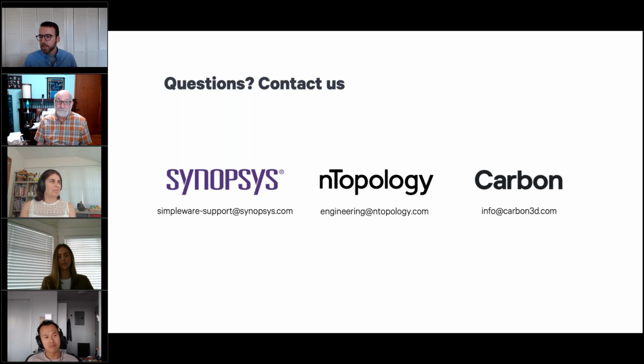We have a couple of questions related to how data is handled and certifications. So I'd love to have all of you comment on this. When is it necessary to send patient data to the cloud? And are these platforms certified by the FDA or by other certifying bodies?